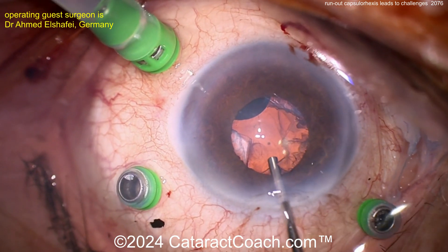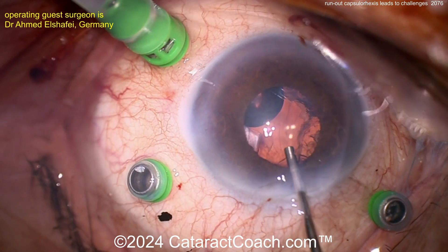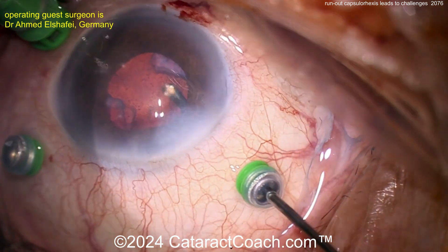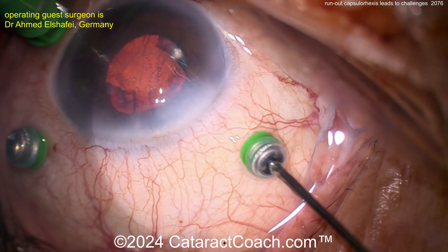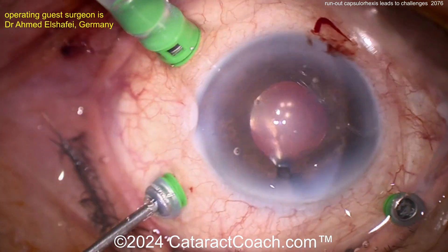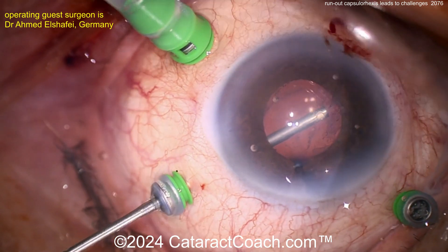That's the vitrector now, cleaning up. Is there vitreous prolapse in the anterior chamber? I'm not sure, but that is the vitrector being used for cleanup. Now going pars plana with the vitrector to aspirate some of that lens material — so maybe the capsule is partially open there. Kind of a daring move to put in a single-piece lens.